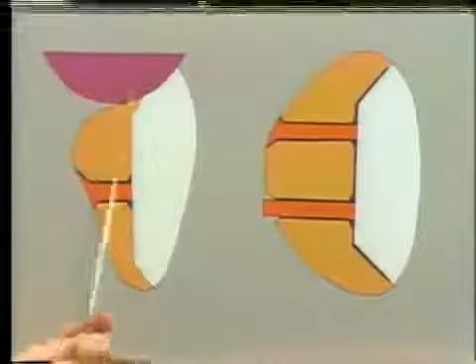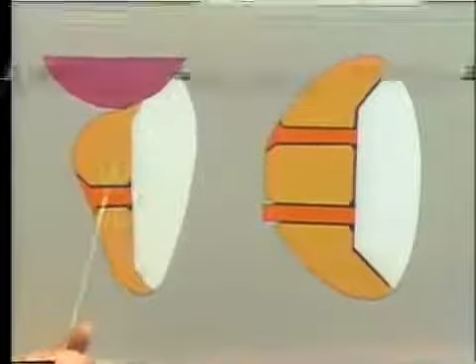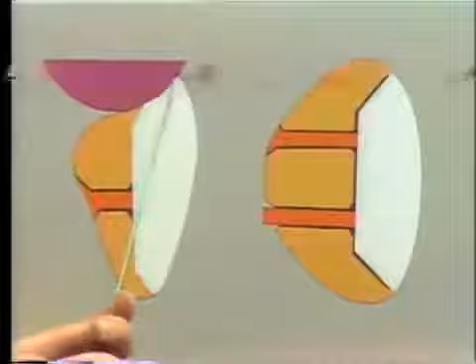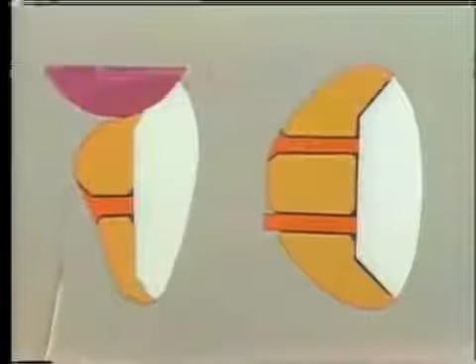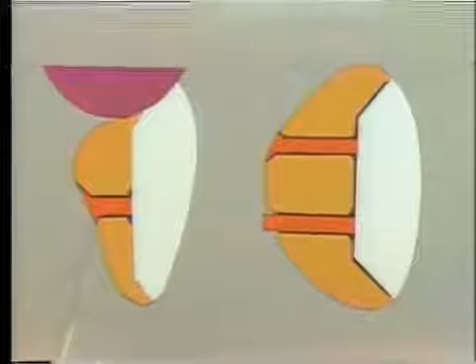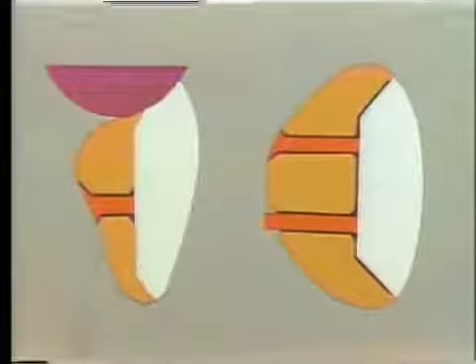Notice that the adaptation of this area to the mucosal tissue here, that the porcelain covers most of this area, is just a little bit of gold in this region here, and this is of course what we have described as the ridge lap adaptation of the Pontic. So here we have gold, the porcelain, the pin going through, and the beveling of that to give a rivet-like finish on this surface here. The black in here represents the cement with which the facing has been fastened in position here.